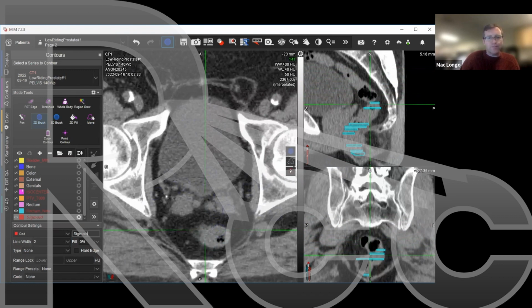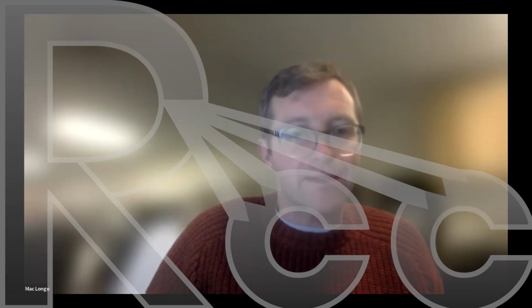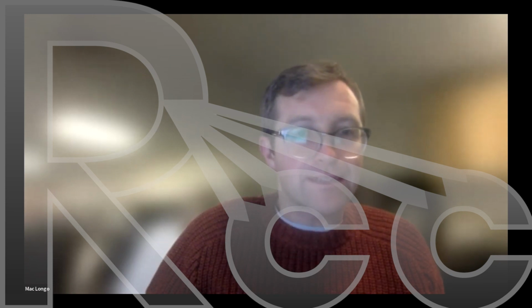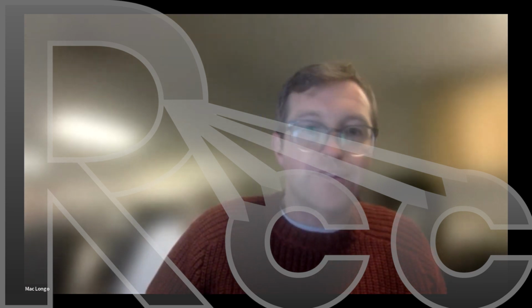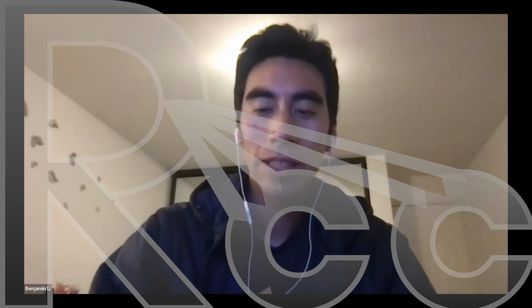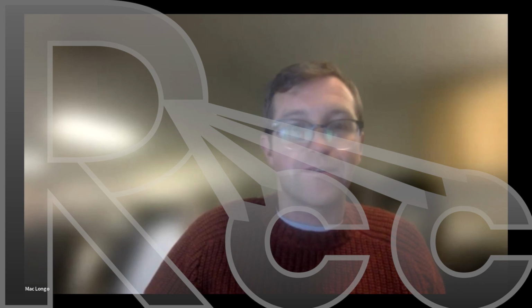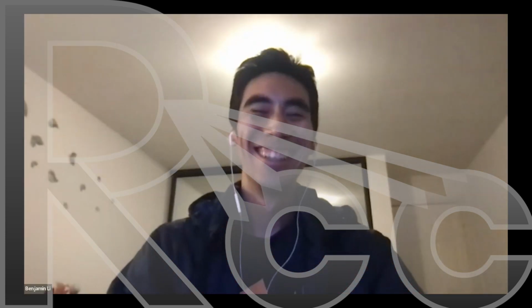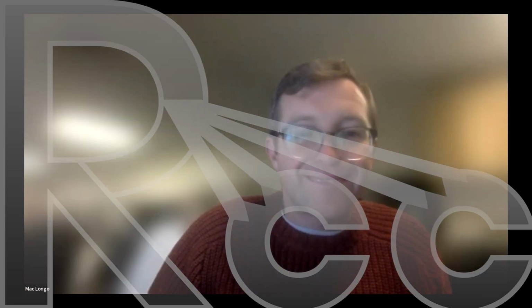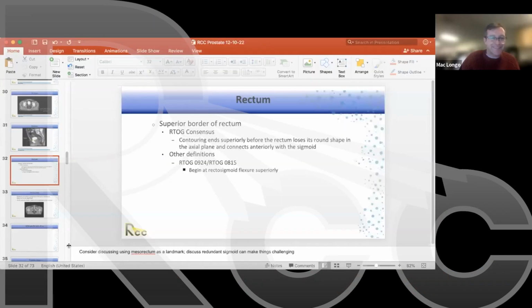Okay. And Ben, do we share the slides with the group afterward? Yeah. Okay, excellent. Because I've included these slides just for your reference going forward. We see this is clearly in the sagittal plane. Can you share the screen of your slides? Oh, I'm sorry. Let me do that. Here I'm just sharing with myself. Hold on here. Sorry. No worries. This is going to be the challenge, everybody.